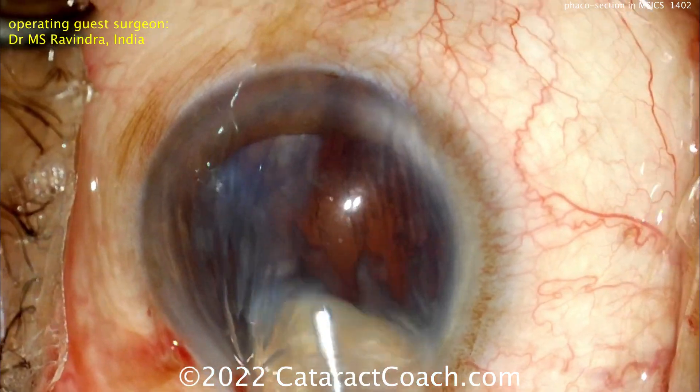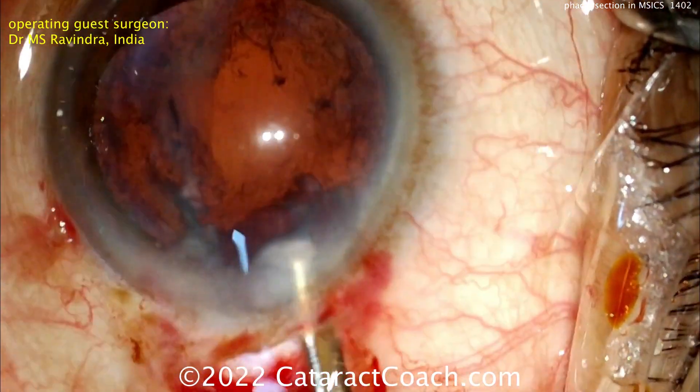We're going to go ahead and pull that second half out of the eye as well. That looks great.